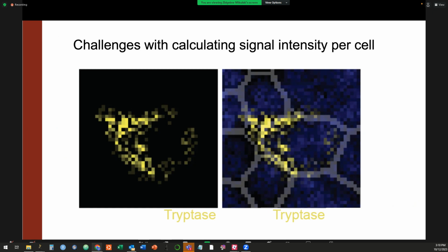And this is the problem you're dealing with when you work starting from what we call a cell table, where you've extracted the counts in each cell. Your data is fundamentally not representing what by eye we see when we look at the images in terms of the distribution of the signal for each of the individual cells. You can imagine this problem gets even more complicated when you have not one, but millions of cells across a panel of multiple different markers.